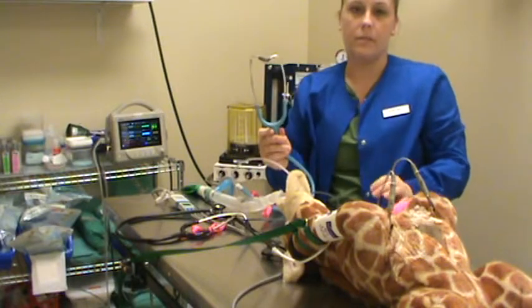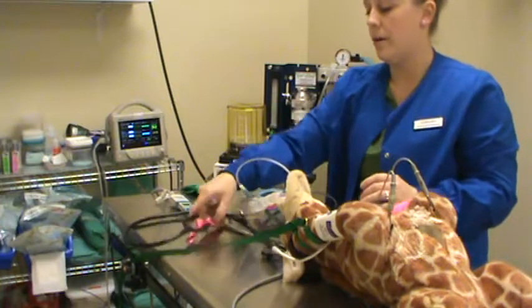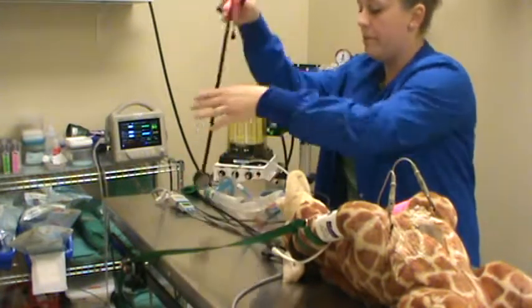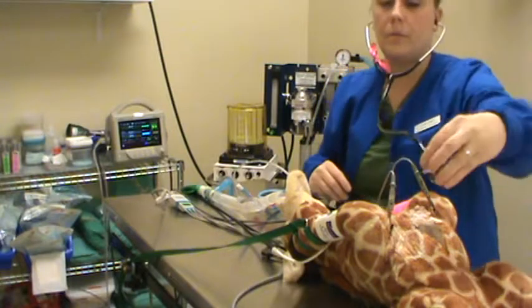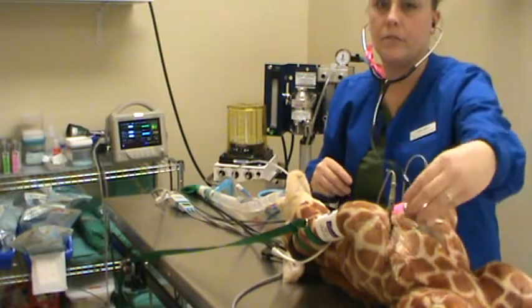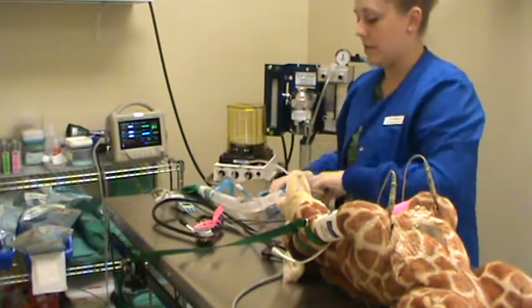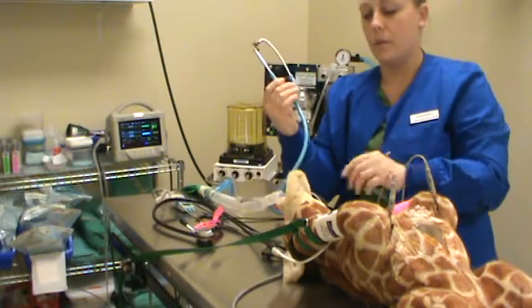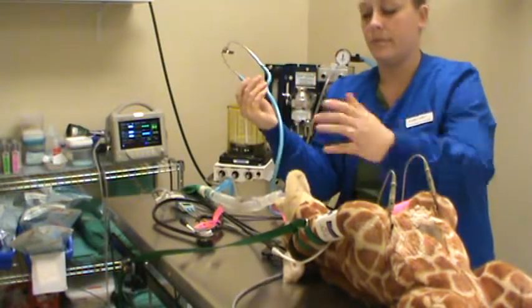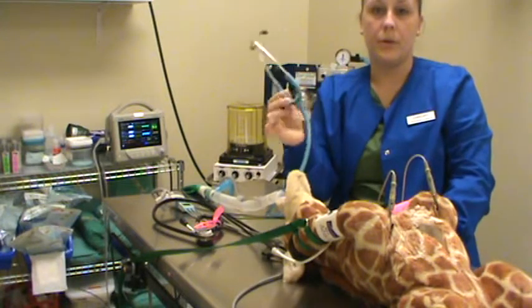What's great about these is they're very non-invasive, and you're usually out of the way of the surgeon. So when you have your regular stethoscope here, like I have, put those in your ears, you might be in the way of the surgery. So if you're reaching into the sterile field, surgeon's not going to like that. So this esophageal stethoscope is great because you're out of the way of the surgeon for the most part of the time, unless they're doing a surgery on the mouth. This is going to be a great non-invasive way to hear heart rate.